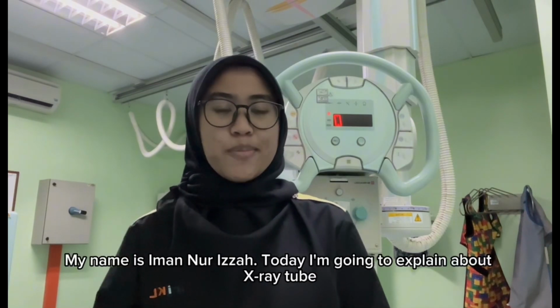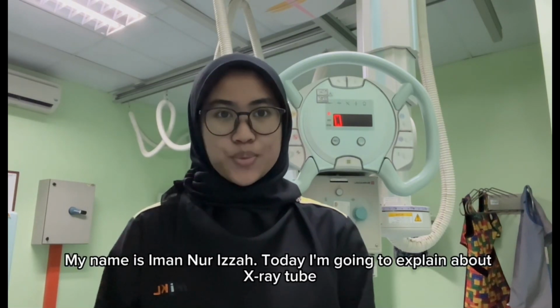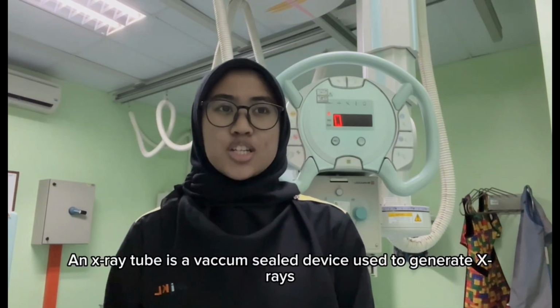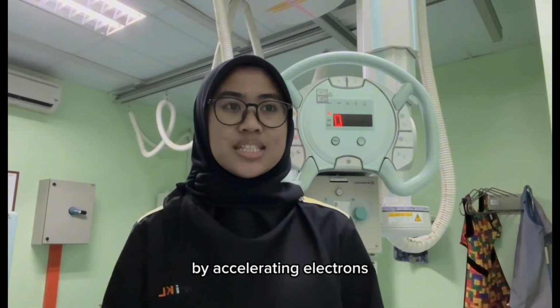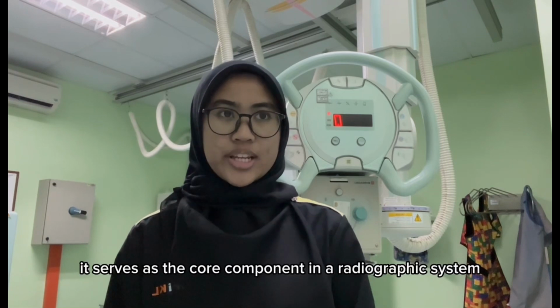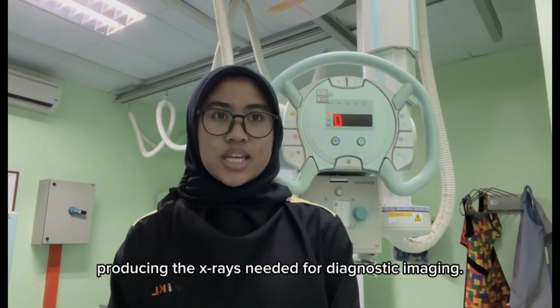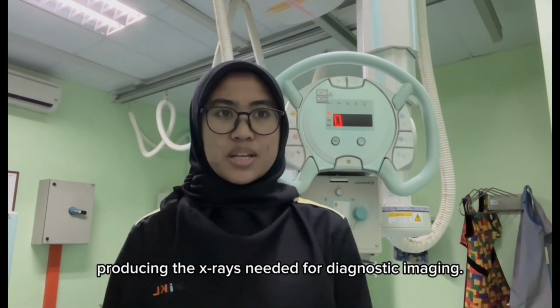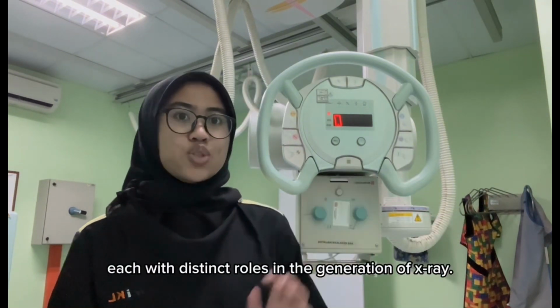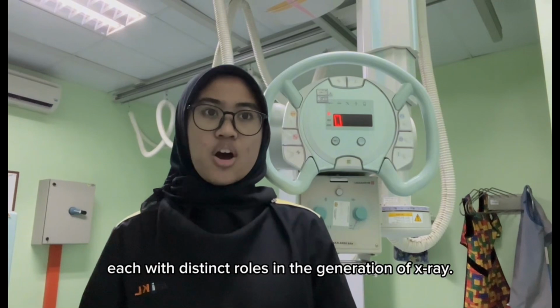So today I'm going to explain about X-ray tube. An X-ray tube is a vacuum-sealed device used to generate X-rays by accelerating electrons and having them collide with a target material. It serves as the core component in a radiographic system, producing the X-ray needed for diagnostic imaging. The tube itself contains an anode and cathode, each with distinct roles in the generation of X-rays.